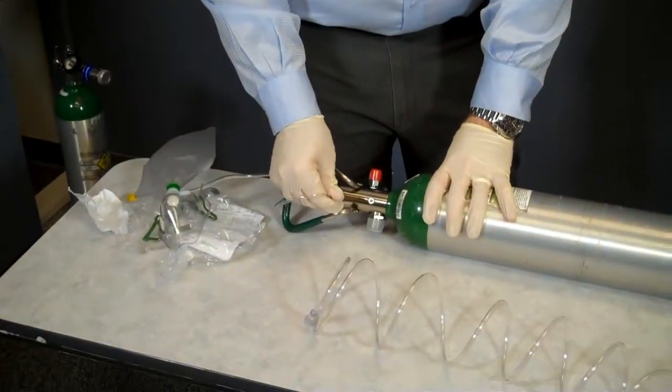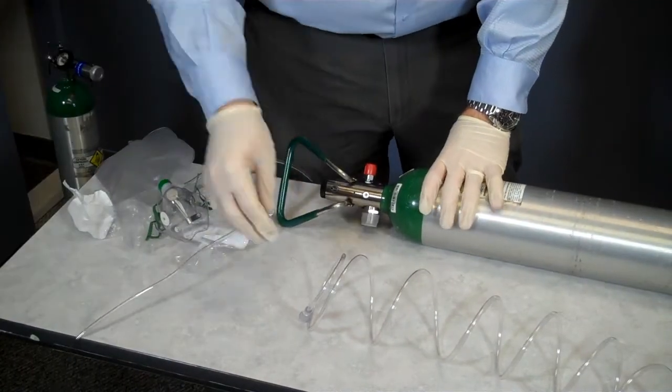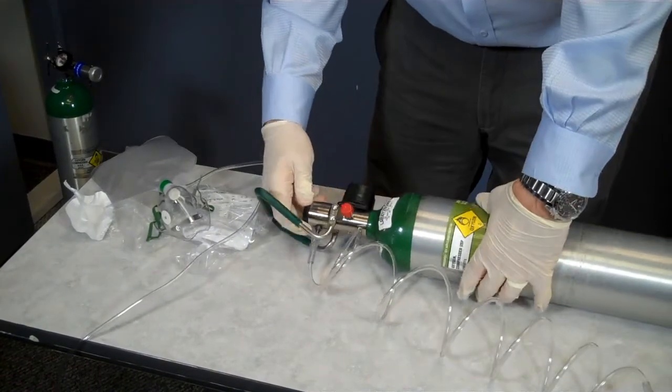I will remove the non-rebreather mask from the patient and regulator, then connect the cannula to the oxygen port valve on the regulator.